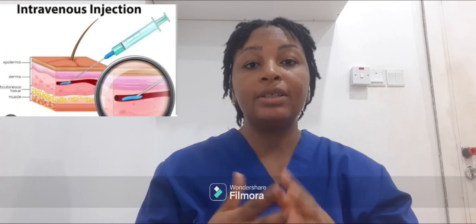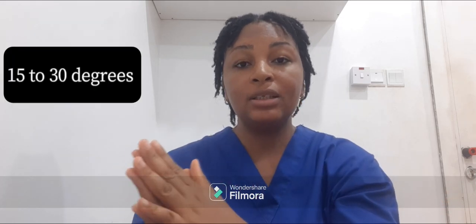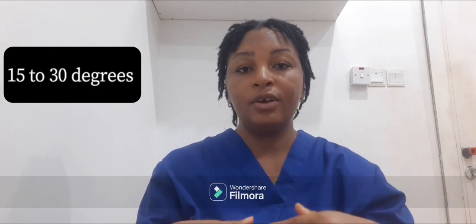This is the intravenous injections. So while giving intravenous injection, or while trying to pass an IV cannula for a patient, you go in at an angle of 15 to 30 degrees, or some people can say at an angle of 25 degrees. So you're trying to get that needle into the blood vessel, the vein, so you go at an angle of 15 to 30 or 25. Okay, that's for intravenous injections.